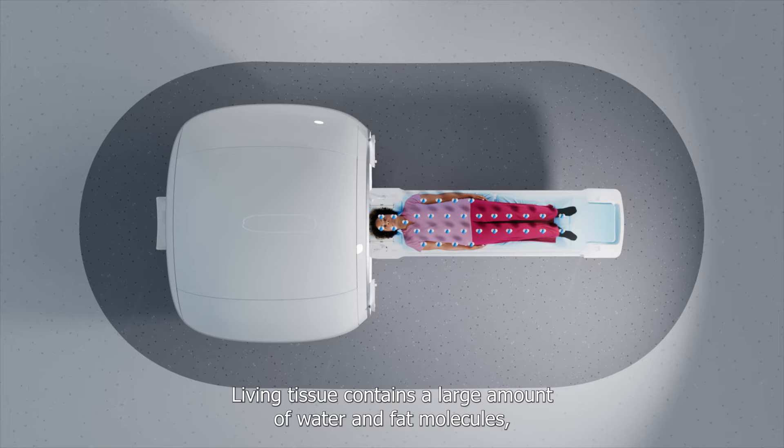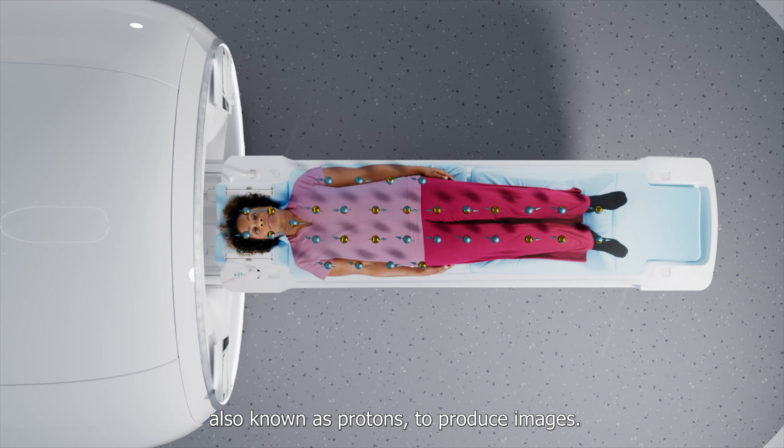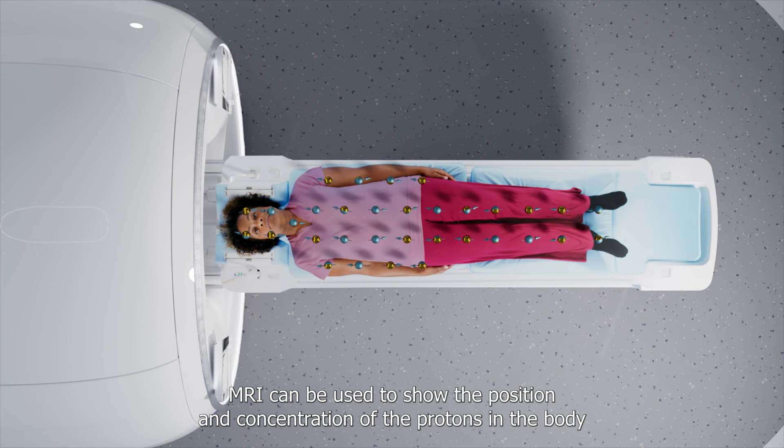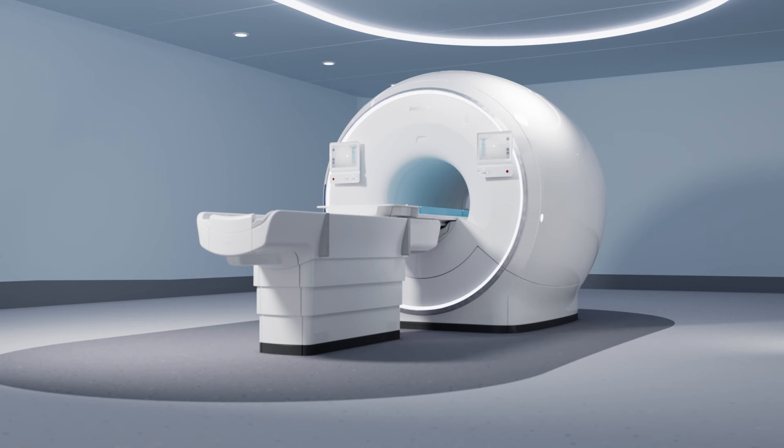Living tissue contains a large amount of water and fat molecules, which contain hydrogen atoms. Magnetic resonance imaging uses the nuclei of these hydrogen atoms, also known as protons, to produce images. MRI can be used to show the position and concentration of the protons in the body, corresponding to the position of the various tissues as well as the tissue characteristics.